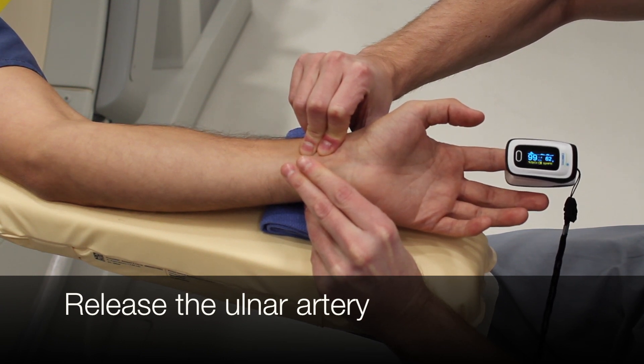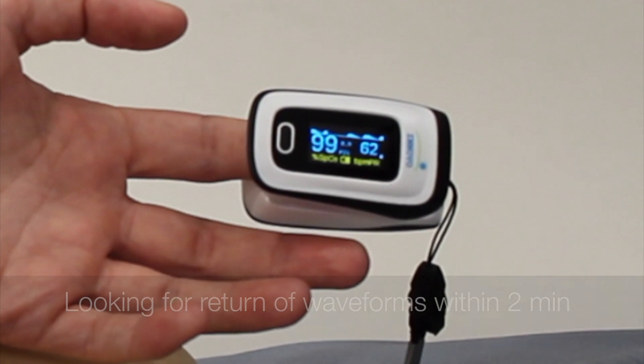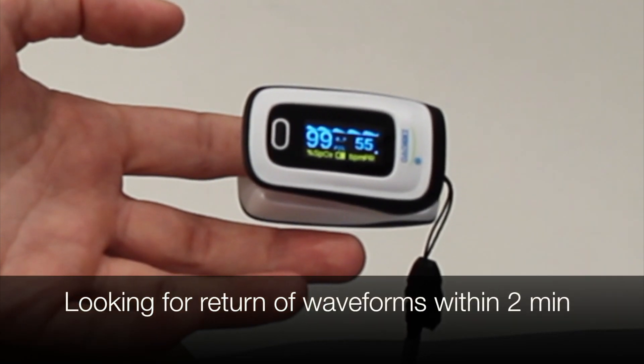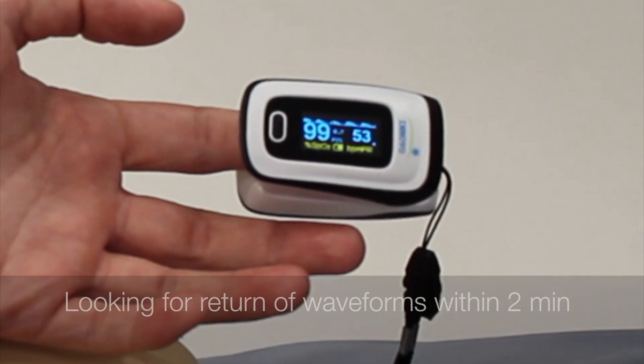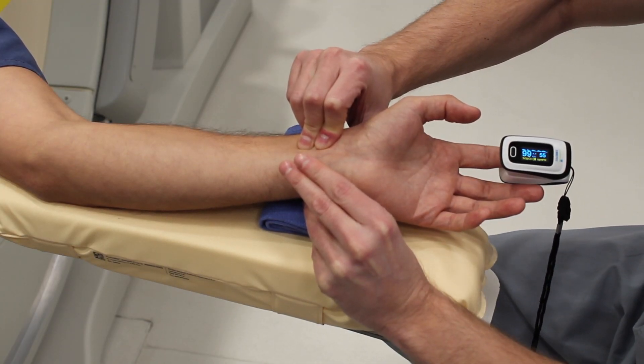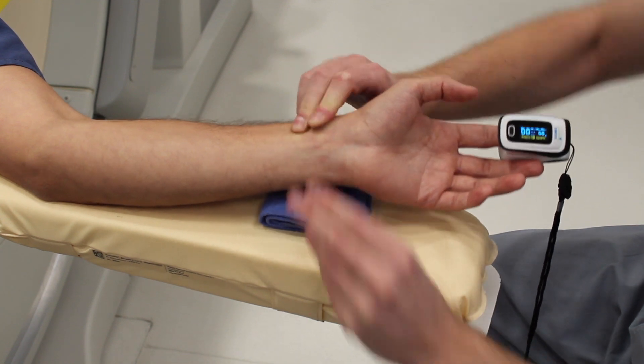In this case he has a Barbeau A. If you're looking for a return of your waveform within two minutes, you have a Barbeau A, B, or C and you should be good to go from a radial access standpoint with regards to the Barbeau test. There are a couple other things you need to look at, but from Barbeau, you should be good to go.